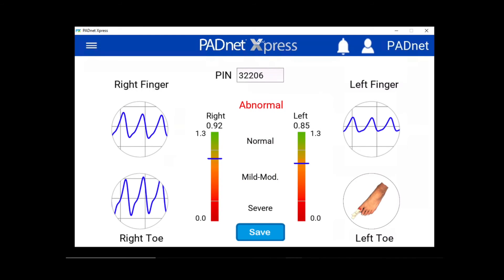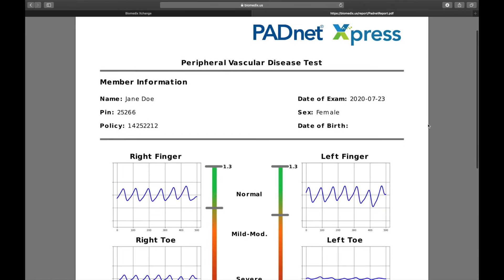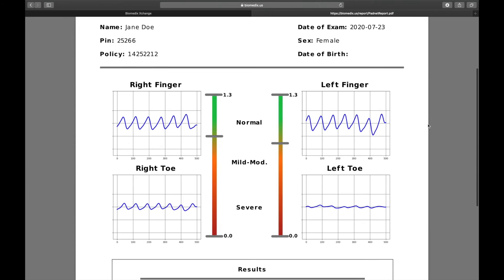Once you've tested all segments, you will get the results. The test will be uploaded to Biomedics Exchange.